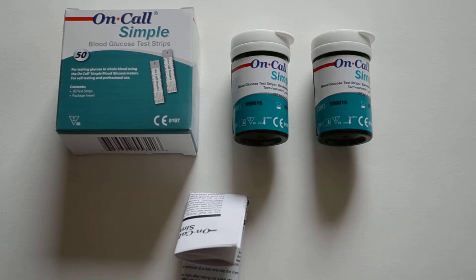Welcome to this product demonstration video showing the On-Call Simple glucose meter test strip packs. On-Call Simple blood glucose test strips are specifically designed to operate in the On-Call Simple blood glucose meter, manufactured and sold by Akon Labs.